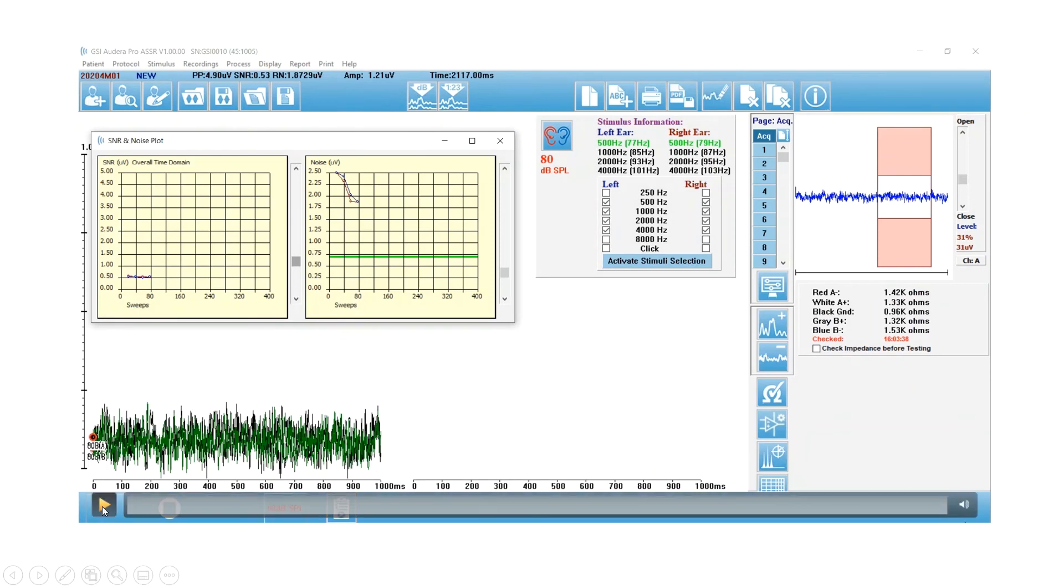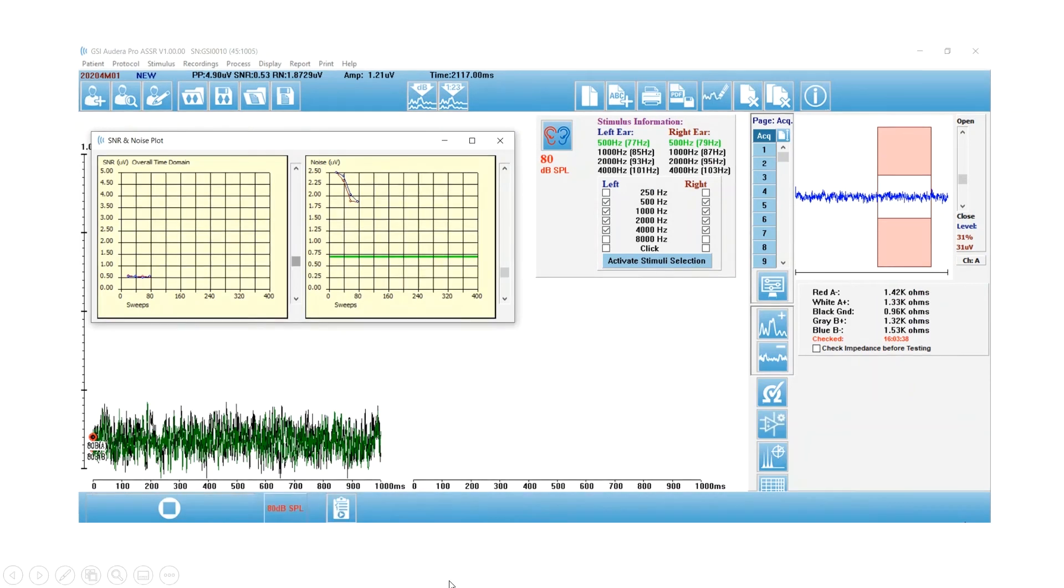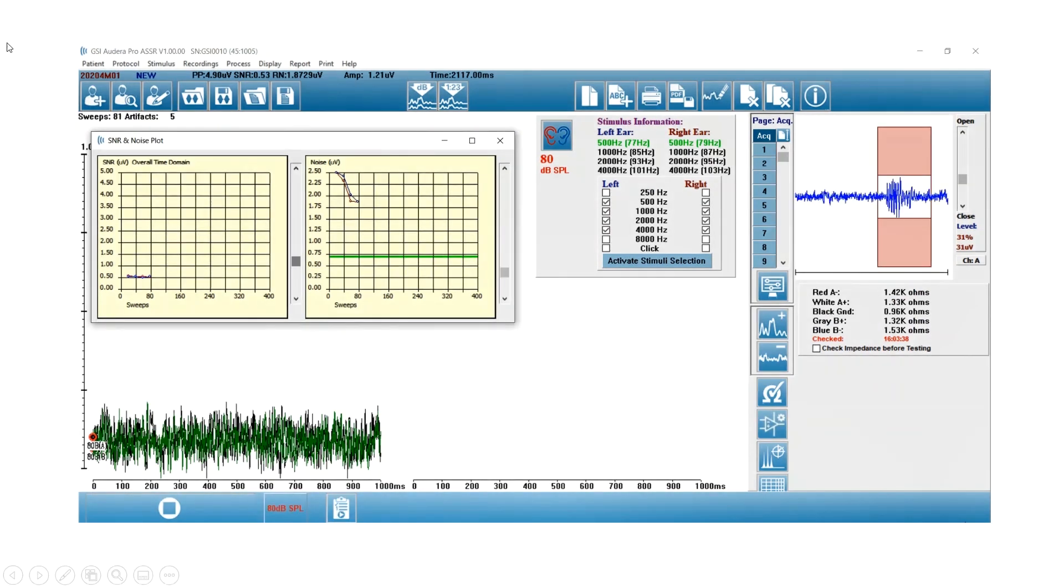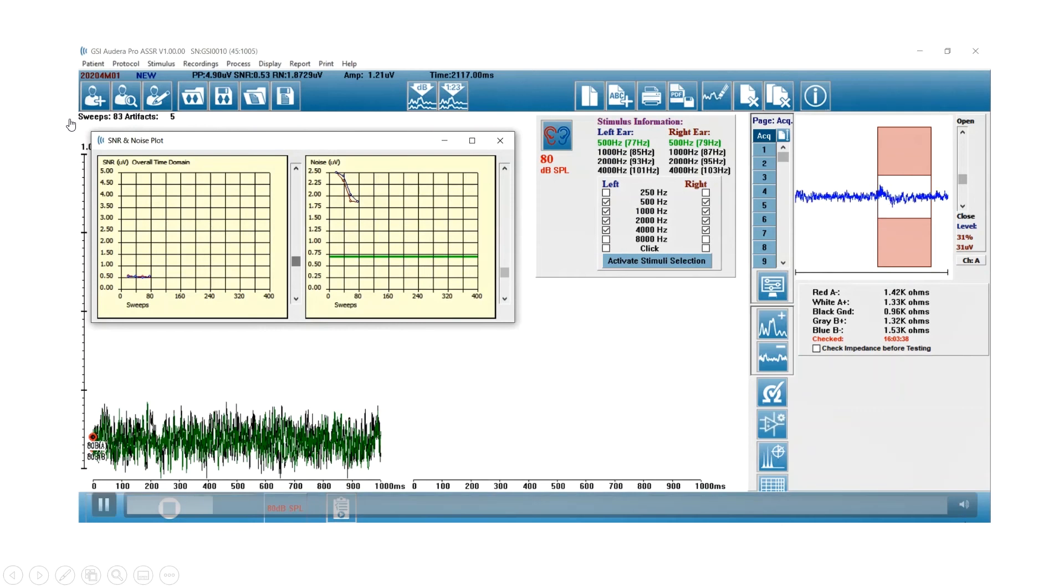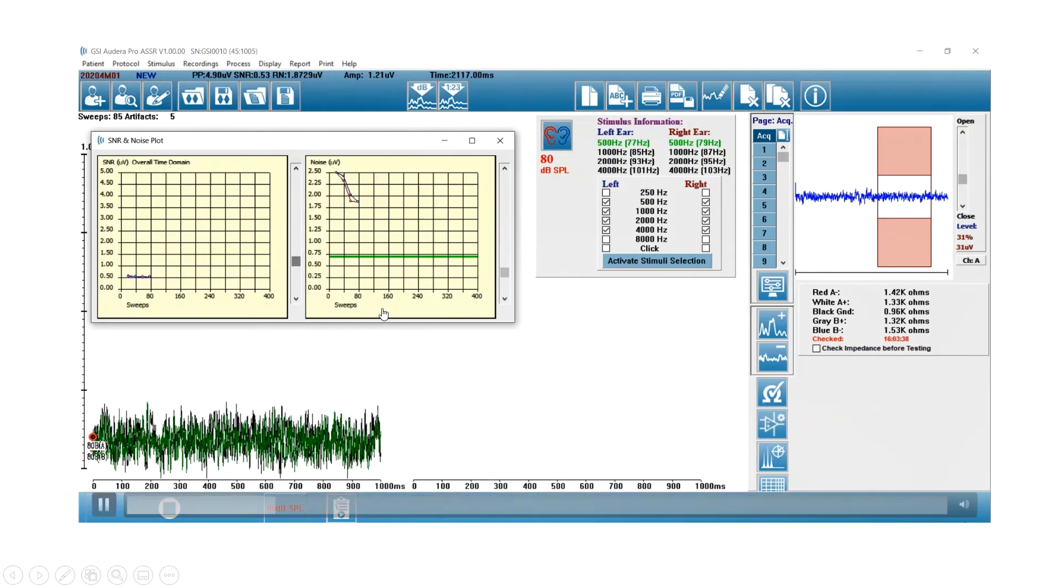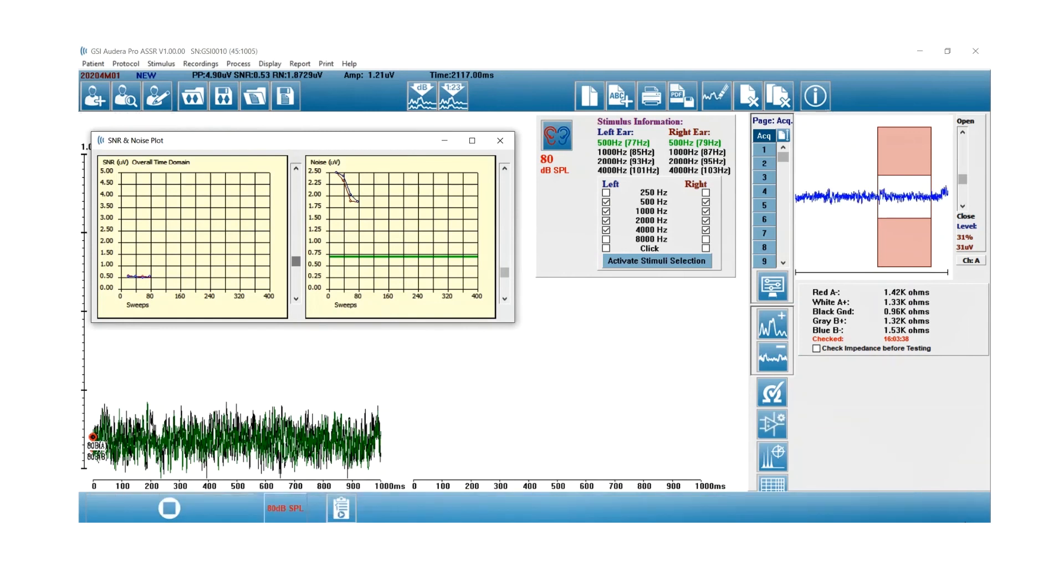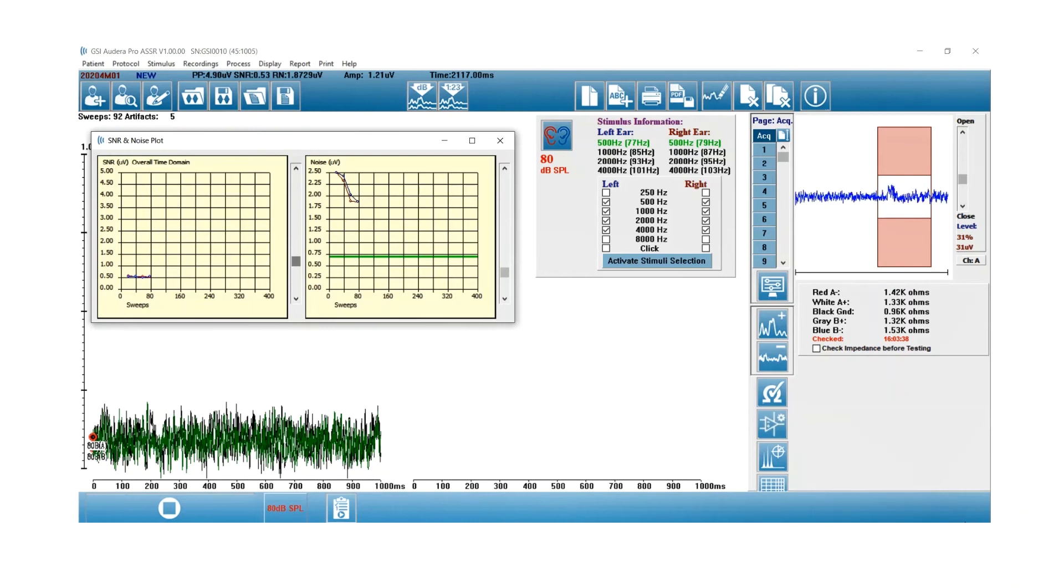So now I'm getting a little bit further along in my recording. If you look at my sweep count, I'm up at 83 sweeps. If you look at my noise level, it's dropping, so I'm plotting my noise over the number of sweeps. As I average, my noise level should go down. That's the principle of averaging.